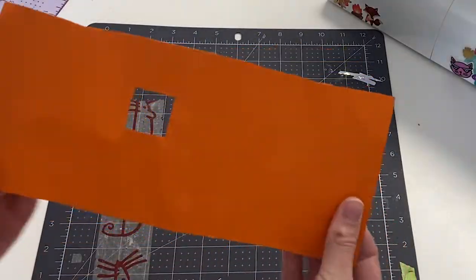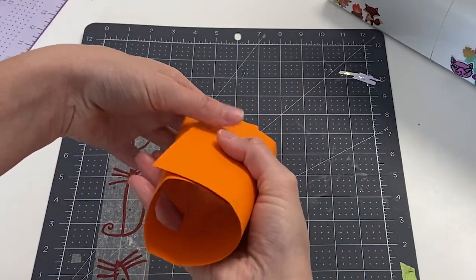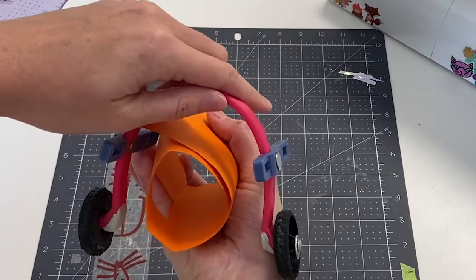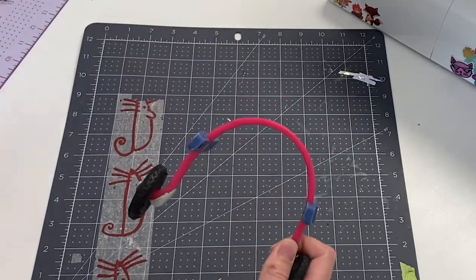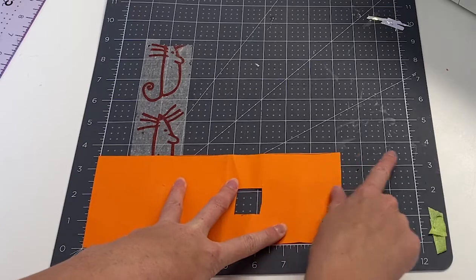With the frame done, I moved on to the sling. I created a template using a piece of paper. There's one hole for her good leg, and where she's missing her leg the sling is just solid. The sling ended up being about 9 inches by 3.5 inches with a 1-inch hole.